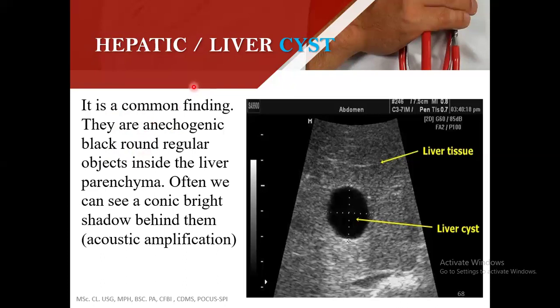Kindly tell her who is going to answer. Kindly tell her that the size should be less than 14 centimeters. 14 cm. Okay. But we are not done. We said something else. Anyone can help? 14 centimeters, depending on the individual structure of the body, either male or female.